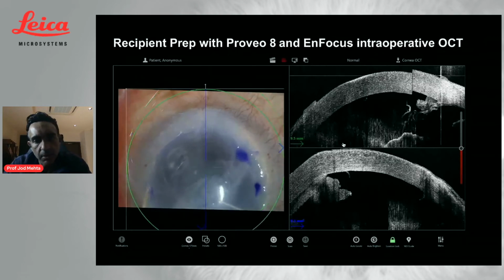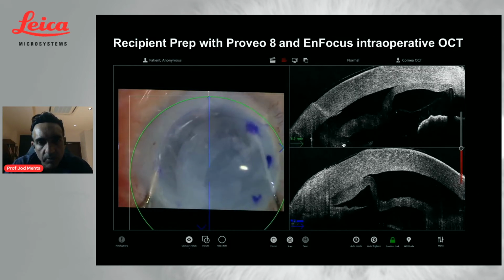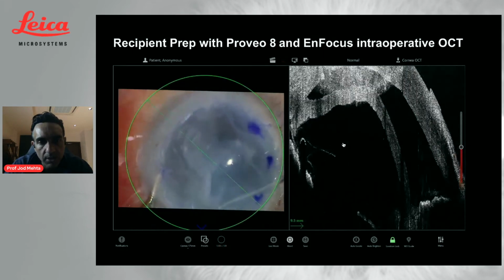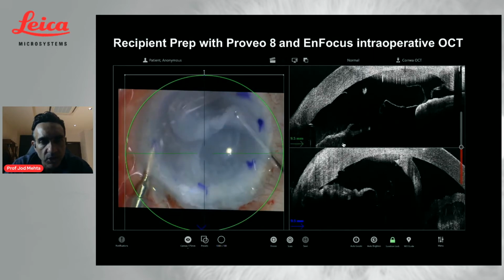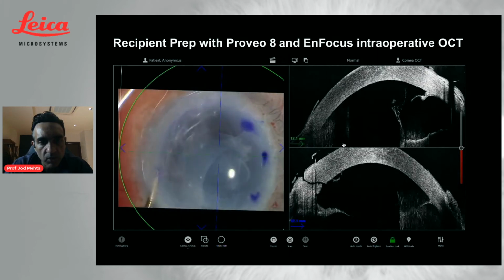Okay, so now it's coming a little bit more, and you can see how much, but I'm having to pull away the edge of the DSEC tissue in order to find the margin and release the PAS. So I've stopped on the other side. I've used the reverse Sinskey to go around now to have another look at where the free edges are, and then I'm trying to release the graft and then eventually remove it to take it out of the eye.